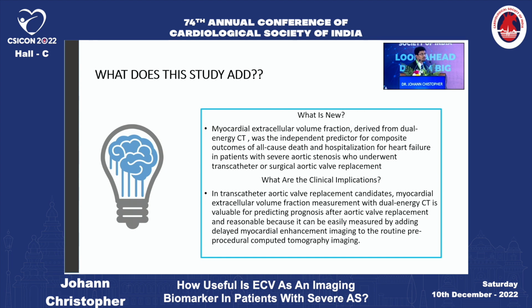We know we have a gold standard test in MRI to measure ECV, but now we do know that even on CT, provided you have the right scanner, which I mentioned could be either a single or dual source, dual energy scanner, that's important. In any way, these scans are done before a TAVR procedure, so you can get a measure of the ECV before going in. And the advantage is that you get the prognosis as well before doing the procedure. So you know how well this person is going to do.